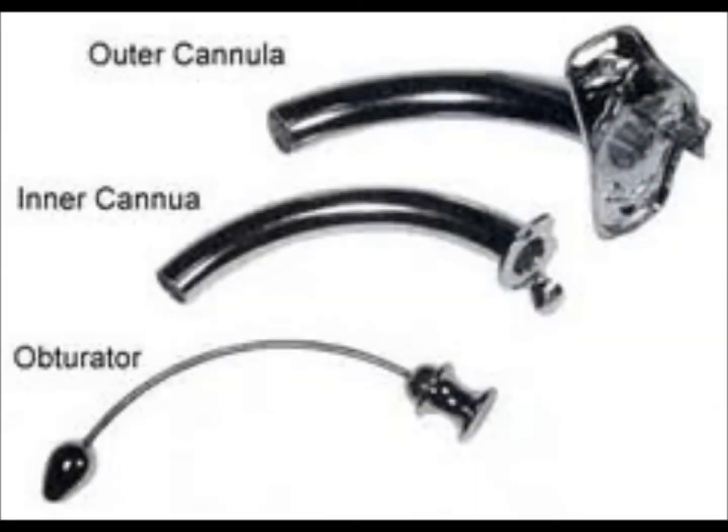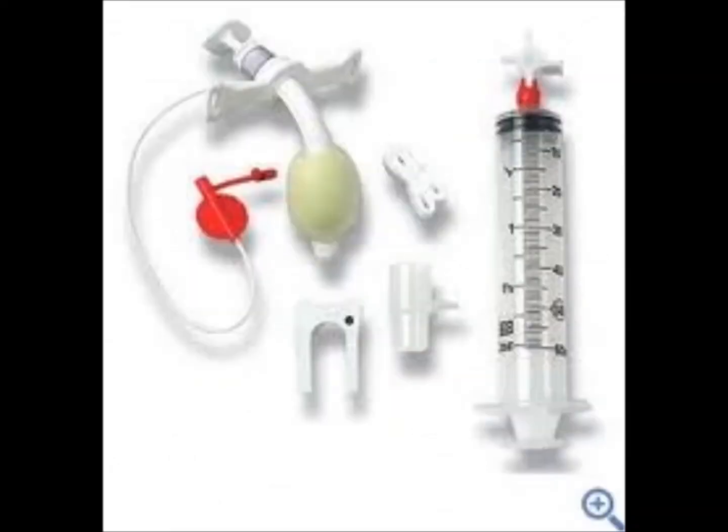This tracheostomy in the picture is an old-fashioned metal trach, not commonly seen anymore. There is no cuff and no fenestration. The inner cannula is not disposable, so it must be cleaned with that special tracheostomy. This tracheostomy tube is called a Bavona trach, which is mostly seen in the pediatric population. This style is known for its comfort, because it has the ability to flex to the patient's trachea. The most important thing to remember with the Bavona trach is to call respiratory if and when a patient is admitted with this style of trach.